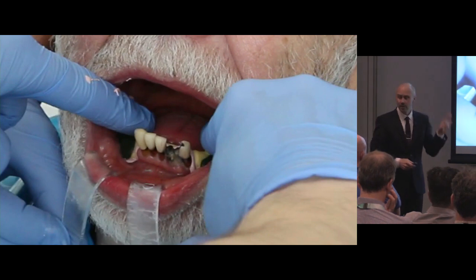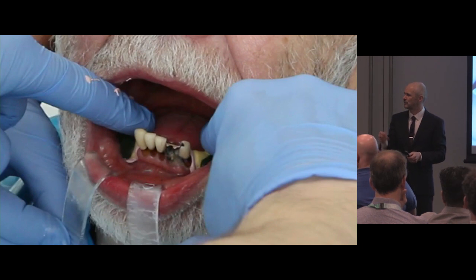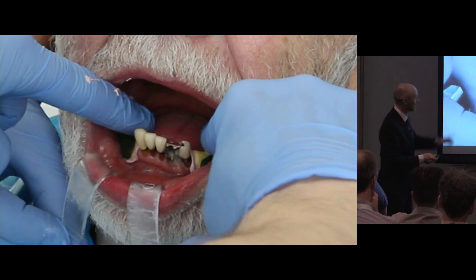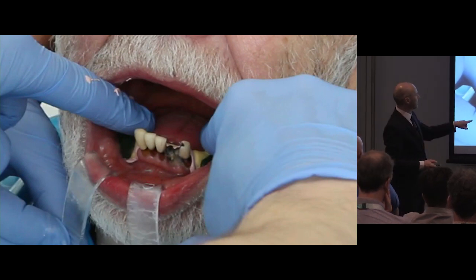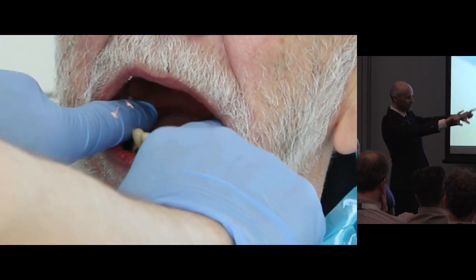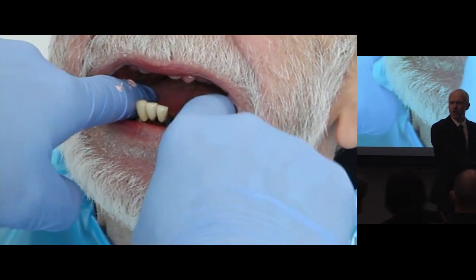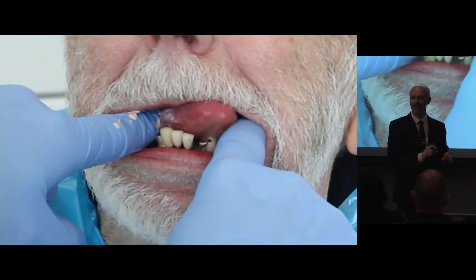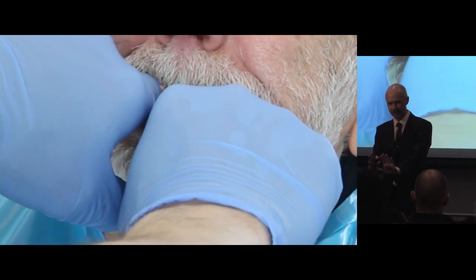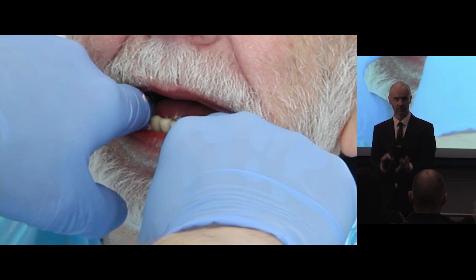So I've seated it down. Is it possible to turn up the sound on my laptop? Is it maxed out? That's fine, I'll just do it verbally. So I'll put it in, push it down. Claire takes that out. I've got my 2 fingers on that, and then I get Bert to go, woo, E, and then lick his lip. Really go for it, licking the lip, push against the lower front teeth, firm with the tongue, and then swallow. So it's those 5 movements.